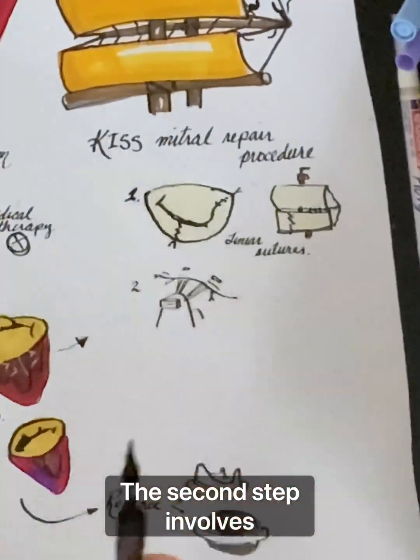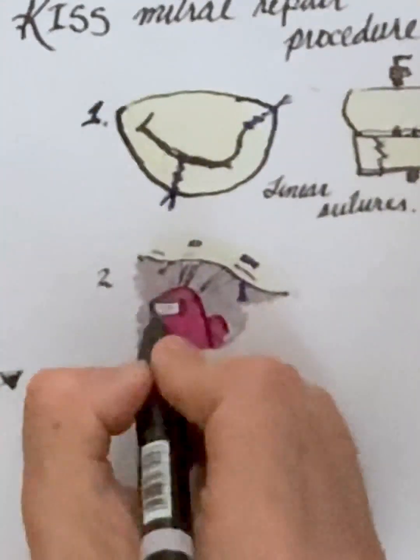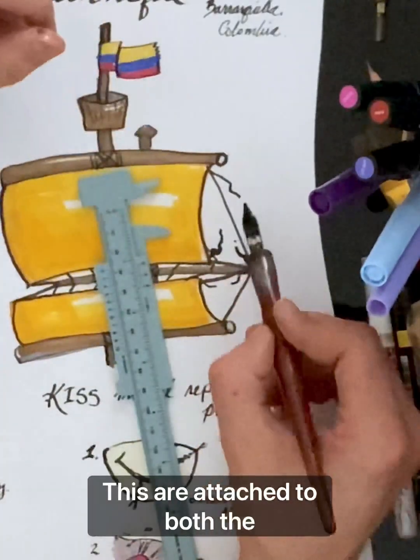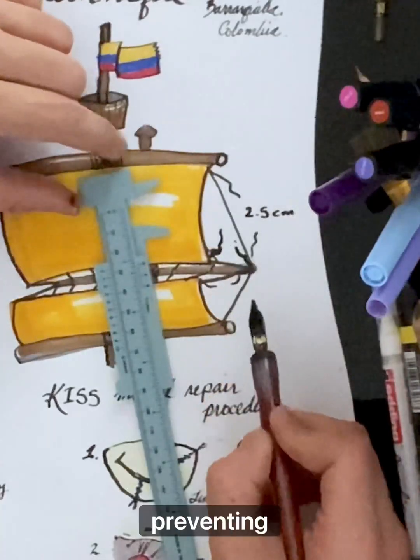The second step involves placement of prefabricated neocords to support the mitral valve. Neocords are made from Gore-Tex, which provides durability and strength. These are attached to both the posterior and anterior leaflets of the valve, providing support and preventing prolapse.